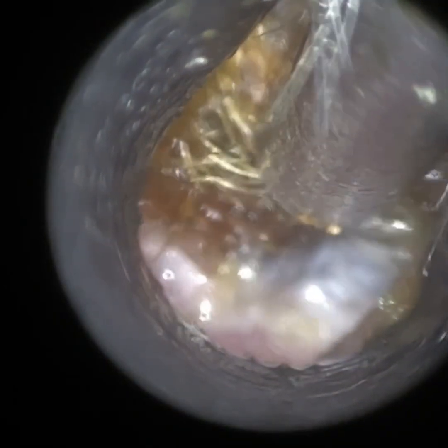This is where it's important as a clinical ear care specialist that you are proficient with all ENT micro-instruments to remove wax, because the alternative is that this patient would have to go away, use drops for a week, and then come back. So it's very important that you are able to remove wax — or even if not remove it outright, that these instruments assist you. Sometimes we use these instruments to facilitate suction.